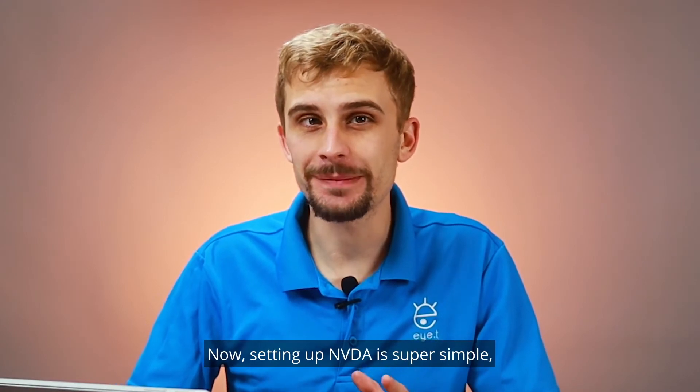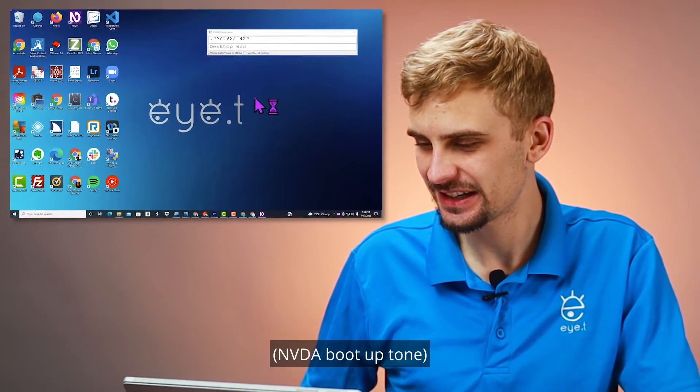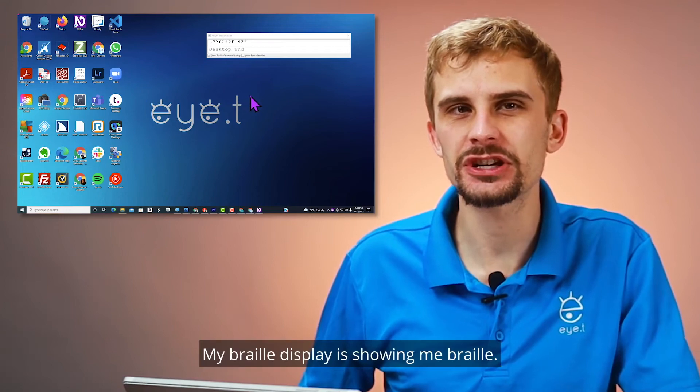Setting up NVDA is super simple. All I have to do is Ctrl-Alt-N to turn on NVDA. Desktop list. Look at that — it's on! My braille display is showing me braille.